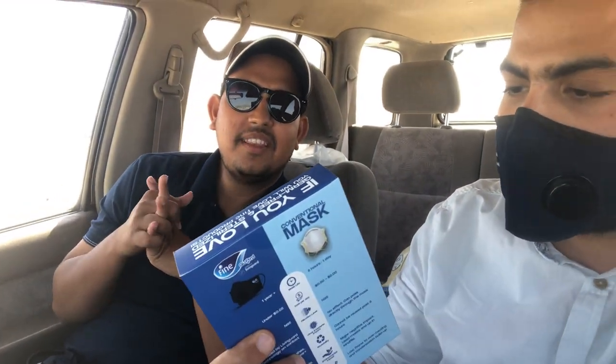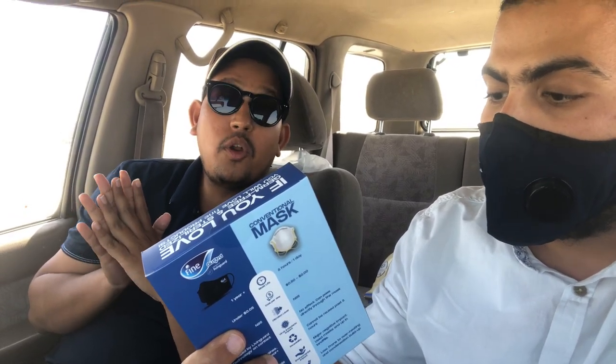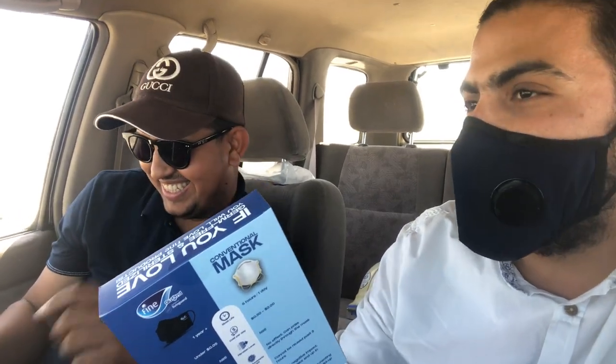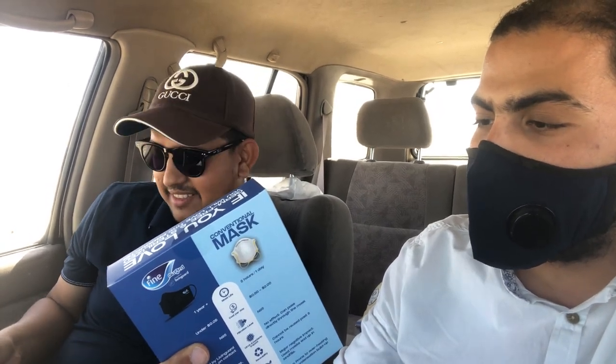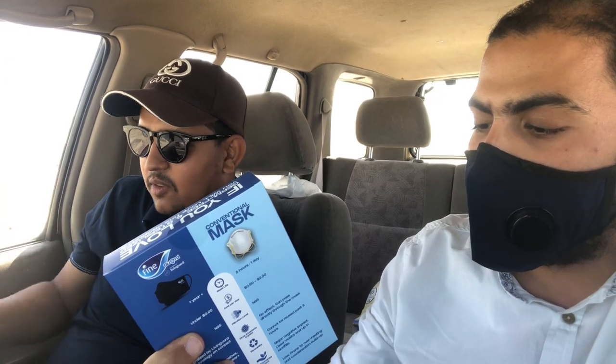It is recommended by the Medical Wellness Association — it is the only mask in the world endorsed by the physicians of the Medical Wellness Association for prevention of infection.